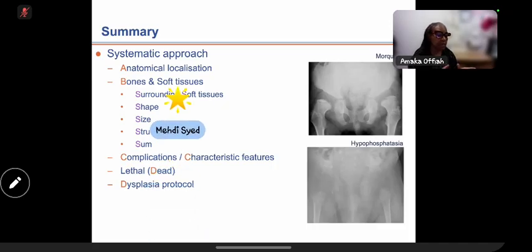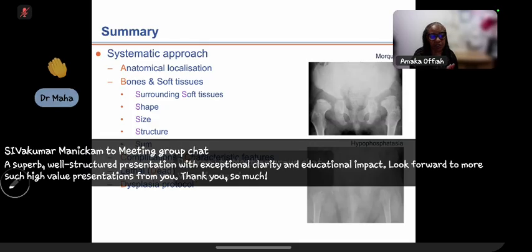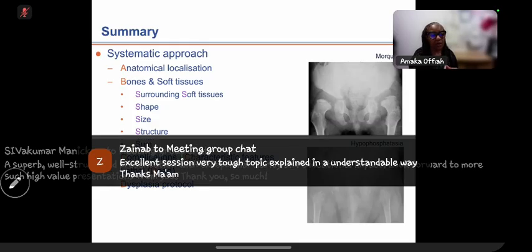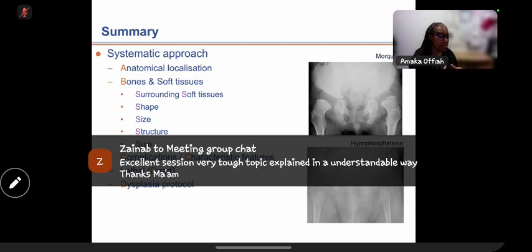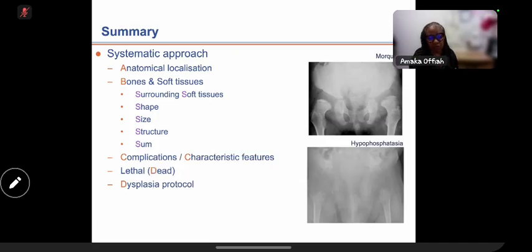The bones may be fewer because they're fused. So things like that give you fusion of the radius and ulna, you should always think about those. We moved on to complications. And remembering that for the child and for the family, the complications are sometimes more important than making a diagnosis if you don't know what the diagnosis is.